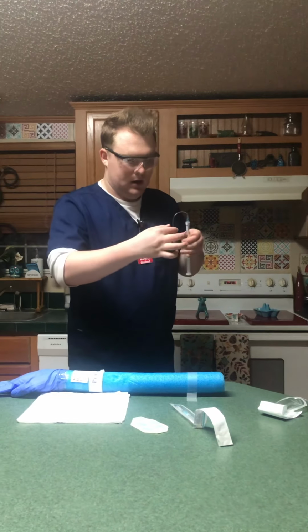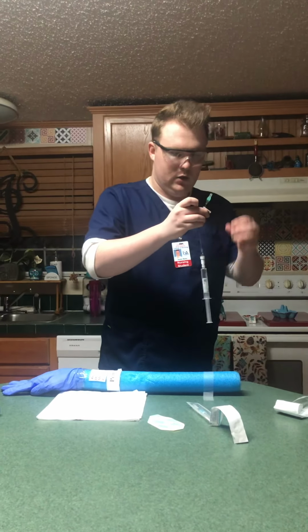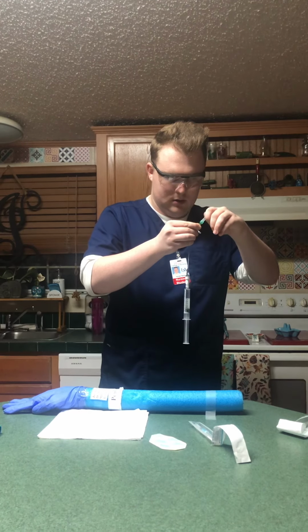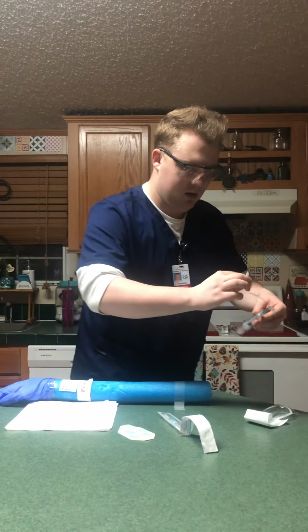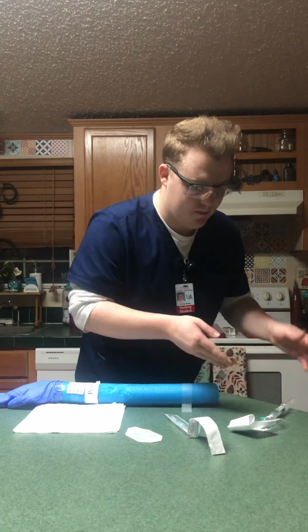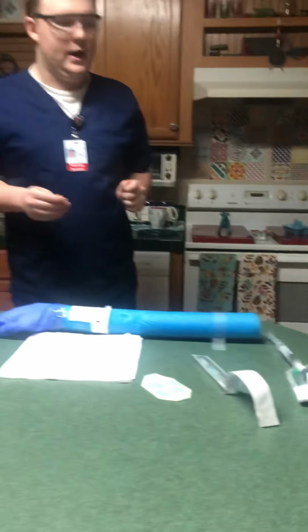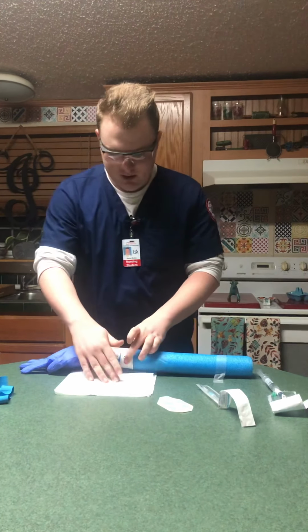Then using sterile technique, I'm going to loosen the hub just a little bit, so it'll be easy to grab, easy to loosen. I'm setting this back in the wrapper like that. Okay, so now what I'm going to do is put the waterproof pad right here.